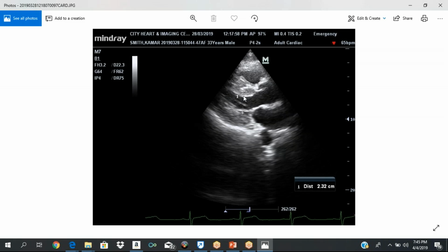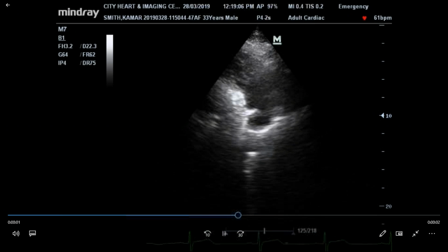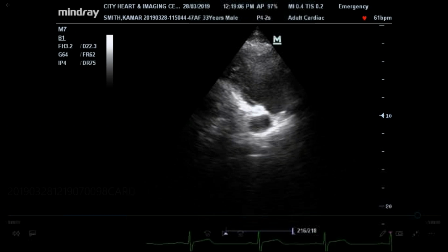And of course, you do your left ventricular cavity size in systole. It's a systolic measurement. So you have to be comfortable with your measurements, because one of the things that you do in echo is measure stuff. You want to see if your chamber size and whatever you're measuring is within normal limits or abnormal.